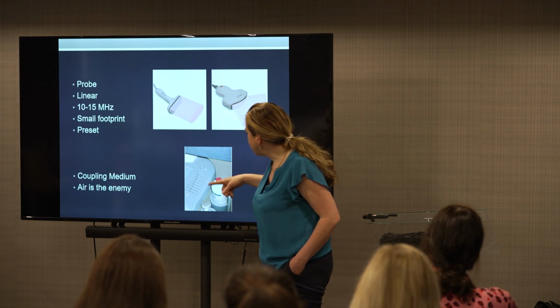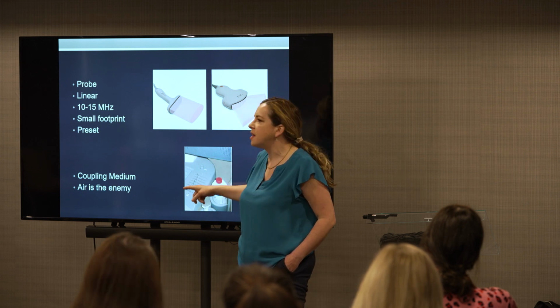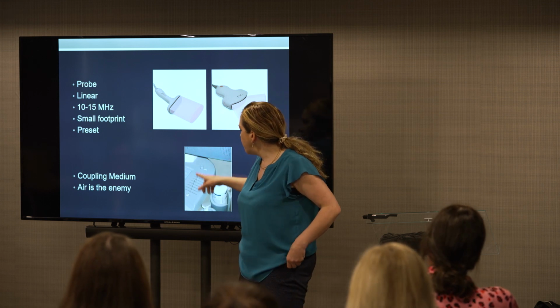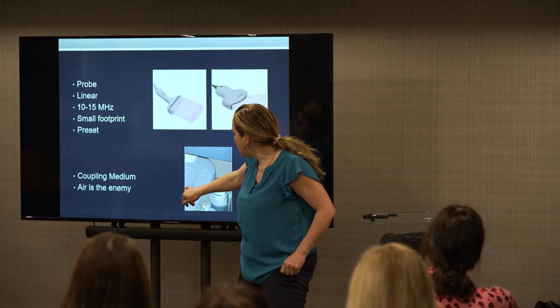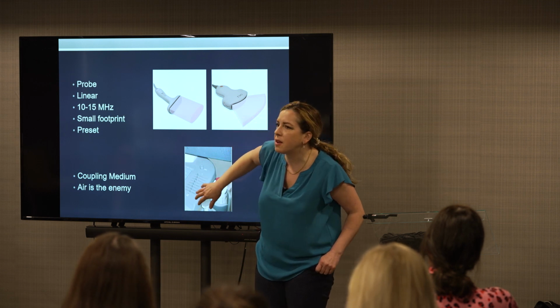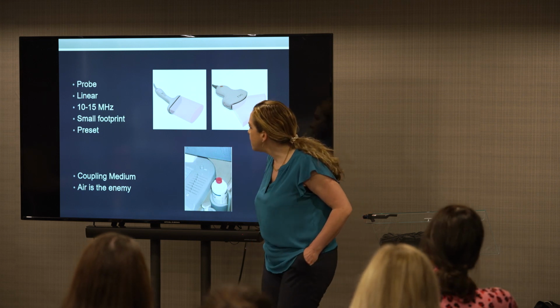Yeah, and this is called time gain compensation. If you're getting to more advanced, making your picture look really good, if the bottom bit of your picture looks dark, you can flick these buttons over this way and they'll make it look brighter. There's lots of things you can do to fiddle with your picture to make it look better. Next slide.